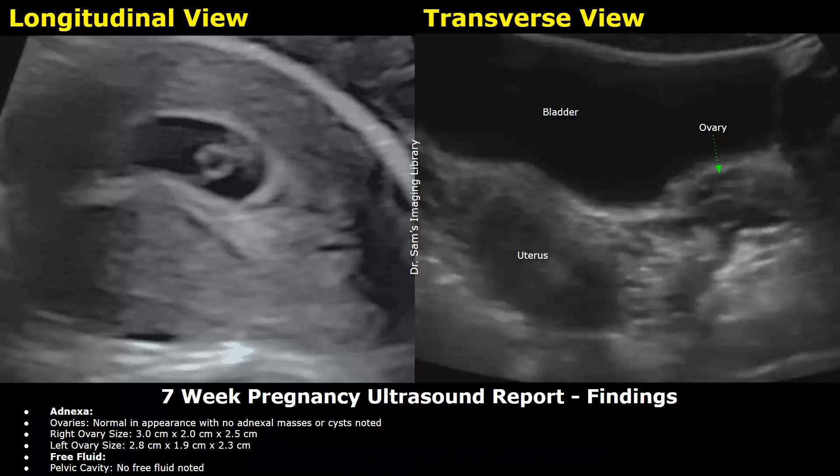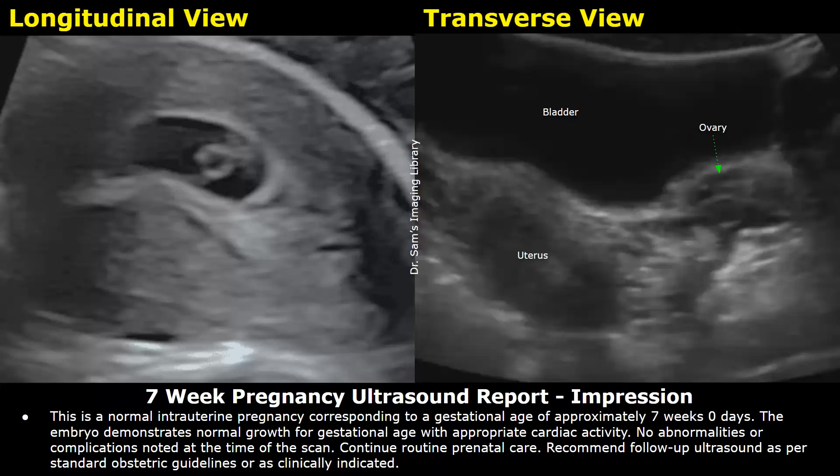After that, you can write about the adnexa. Ovaries — normal in appearance with no adnexal masses or cysts noted. Then write the sizes of the right and left ovaries. For free fluid — pelvic cavity: no free fluid noted in this example. Finally, write the impression: a normal intrauterine pregnancy corresponding to a gestational age of approximately 7 weeks, 0 days. The embryo demonstrates normal growth for gestational age with appropriate cardiac activity. No abnormalities or complications noted at the time of the scan. Continue routine prenatal care.